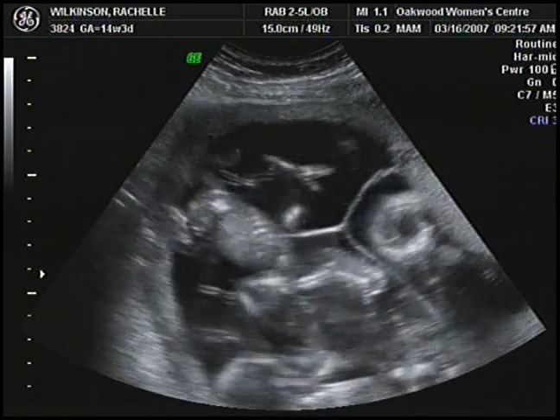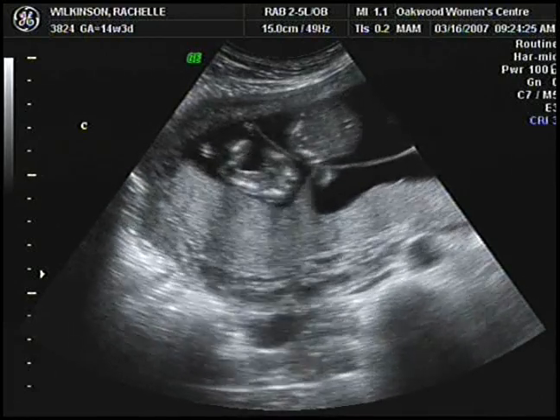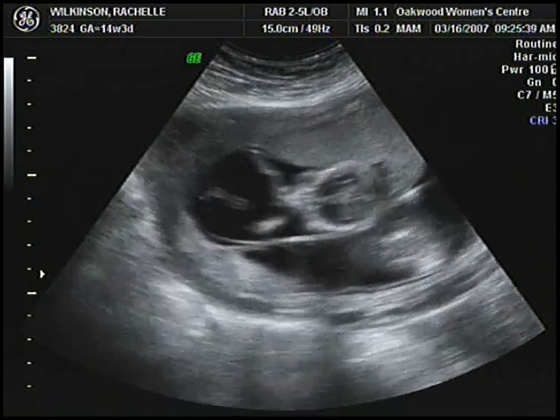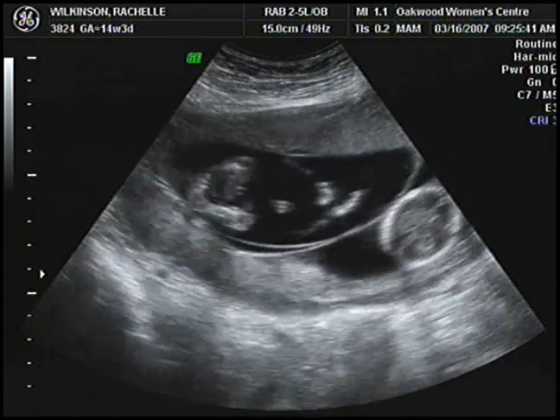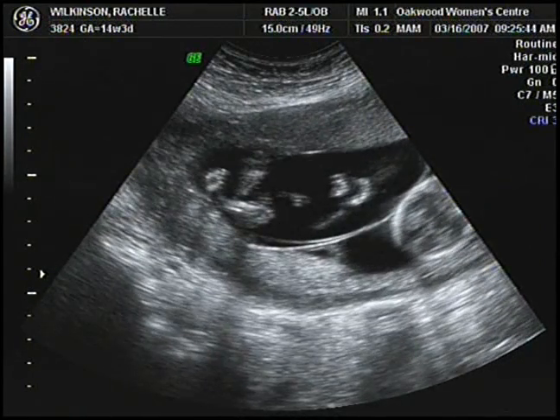Next, I wanted to show this particular shot just because this was something we dealt with during this whole ultrasound. We were trying to find out the sex of the babies during this ultrasound, and they almost all had their legs crossed, as you can see in this shot as well. You can see a little foot there, little hands, but the legs were crossed, making it fairly difficult.